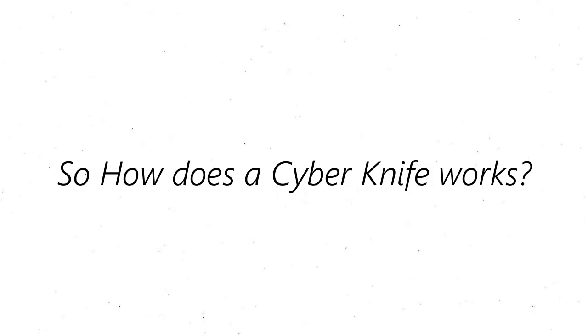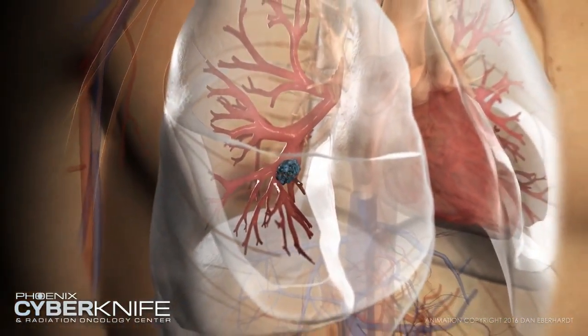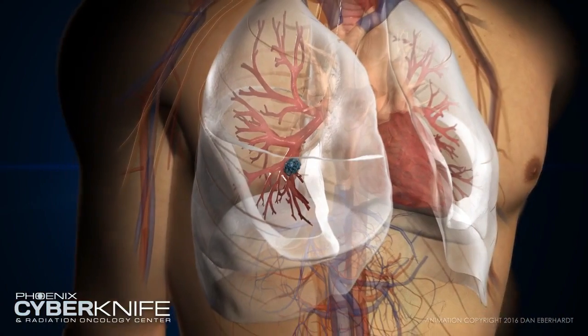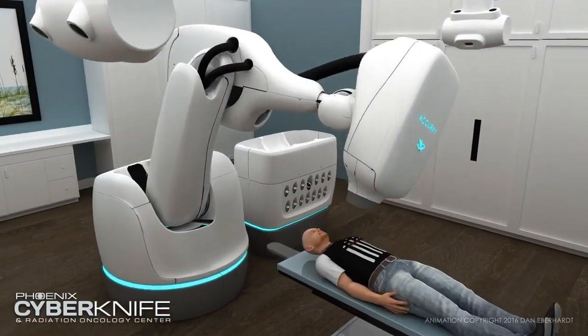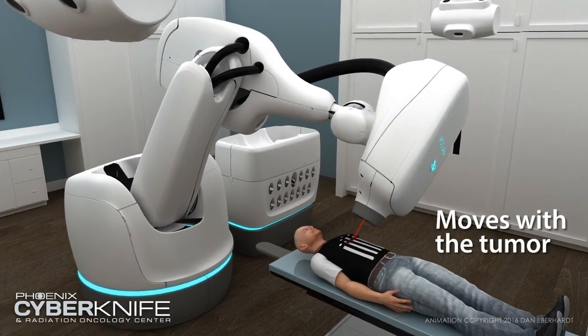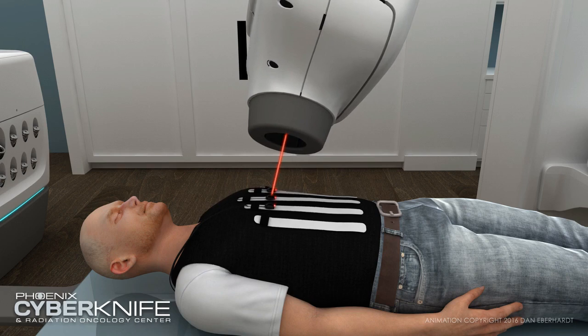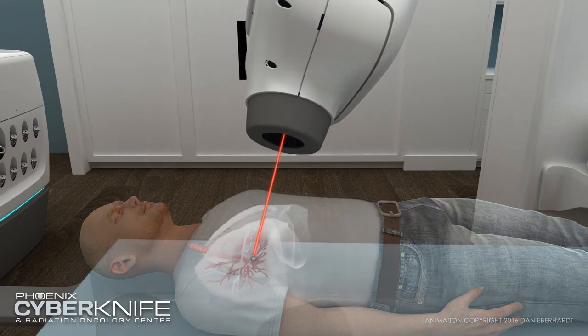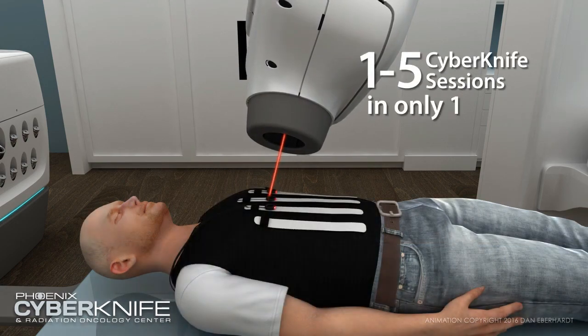So how does a CyberKnife work? The CyberKnife system is the only radiation delivery system that features a linear accelerator or LINAC directly mounted on a robot to deliver the high-energy x-rays or photons used in radiation therapy. The robot moves and bends around the patient to deliver radiation doses from potentially thousands of unique beam angles, significantly expanding the possible positions to concentrate radiation to the tumor while minimizing dose to surrounding healthy tissue.